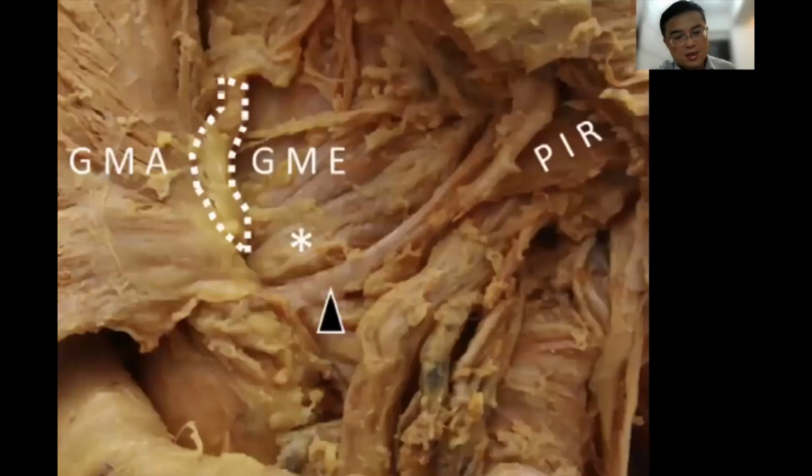So this is the cadaveric picture. As you can see, the fat marked by the dashed area is located underneath the gluteus maximus.